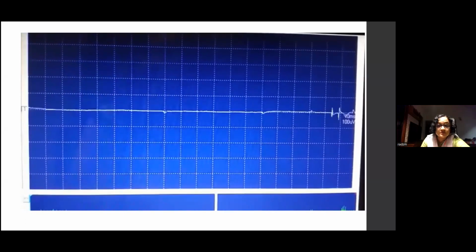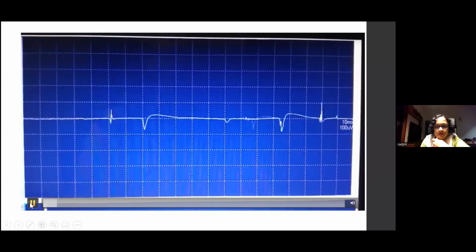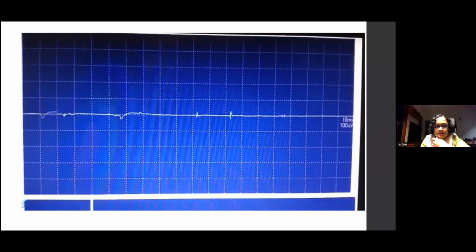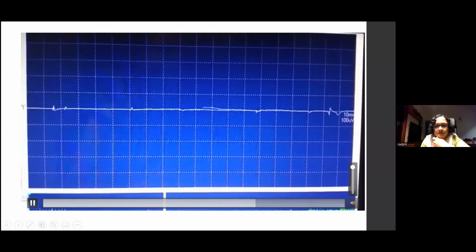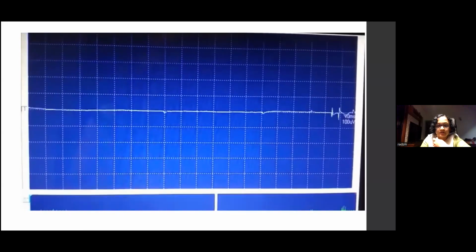Okay, so, yeah. The EMG sound is not very audible. Not very loud. Is it possible to adjust that? Yeah, just bring it up a little bit. Okay, one second. I think that's the highest. So that's like rain on the tin roof.